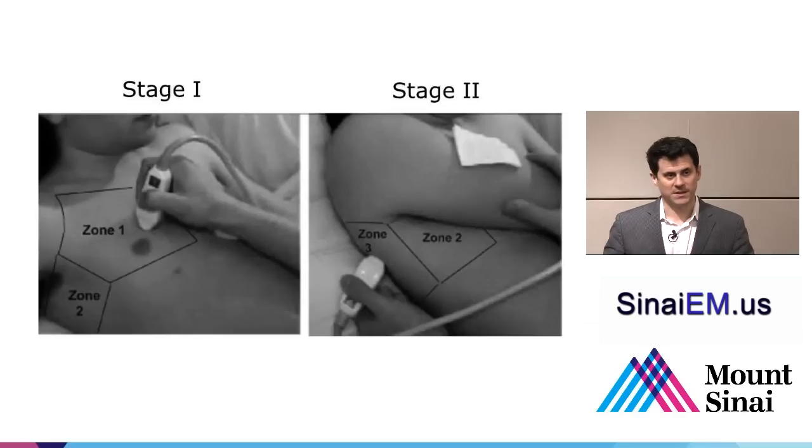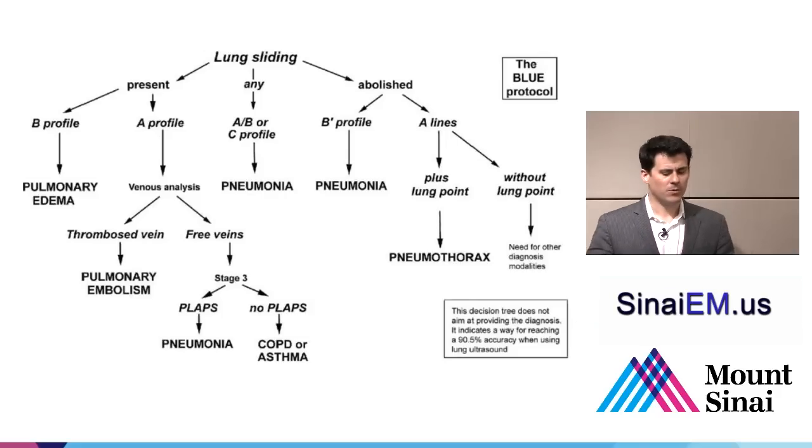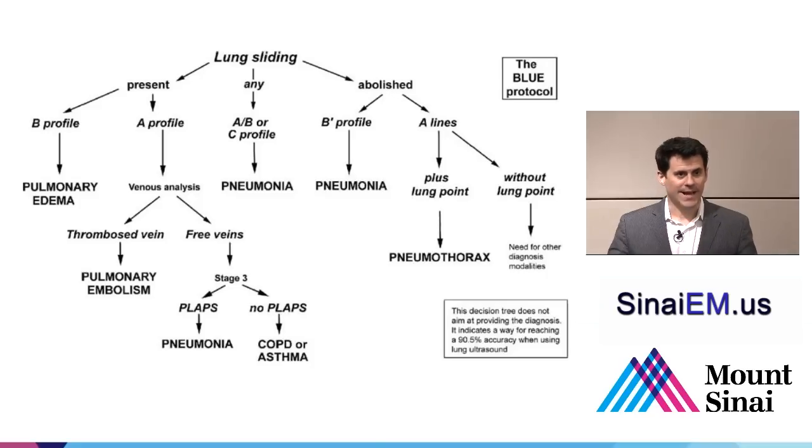So it's a relatively straightforward assessment. There's not a lot of rib spaces to remember, not a lot of anatomy or landmarks to worry about. And what we would look for is this. It seems complicated at first, but primarily we're going to look for lung sliding. And the absence of lung sliding overall is generally concerning for pneumothorax. We're also going to look for a B profile. The B profile, with lots of B lines, lots of lung rockets, comet tails, is concerning for pulmonary edema. If there is a consolidation in the lung, that's consistent with pneumonia, again, beyond the scope of this talk, but that's another component to thoracic sonography that's worth keeping in mind. And again, if we find A lines, but there is no lung sliding, very concerning for pneumothorax.